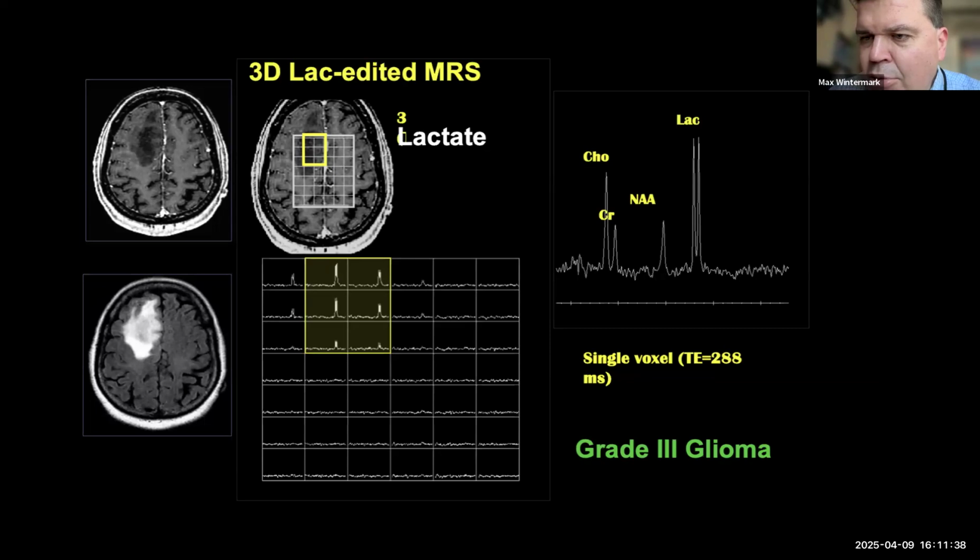They have been used to try to characterize abscesses, to differentiate different types of abscesses and toxoplasmosis, to try to differentiate between glioblastoma and lymphoma. So there is definitely an application. The challenge again is the lack of specificity. So it's helpful, it's not perfect. It doesn't always give you the final answer.